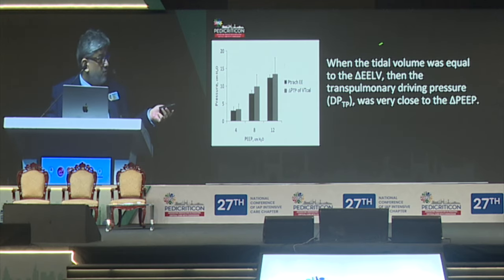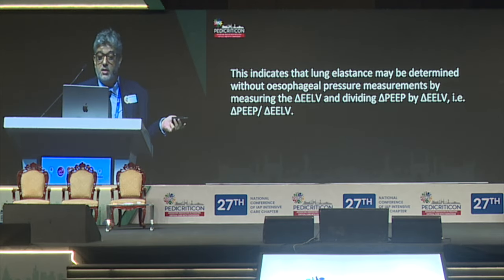So they found that if your tidal volume was equal to the change in the end expiratory lung volume, then your change in PEEP is equal to the change in transpulmonary pressure. This is a very important finding.